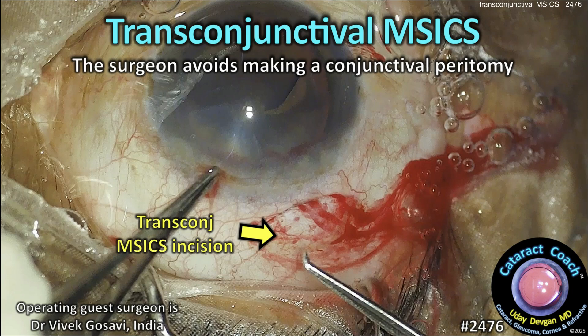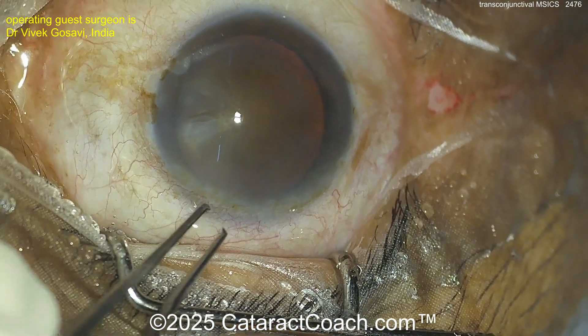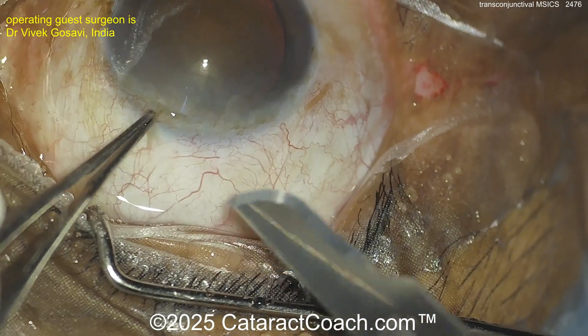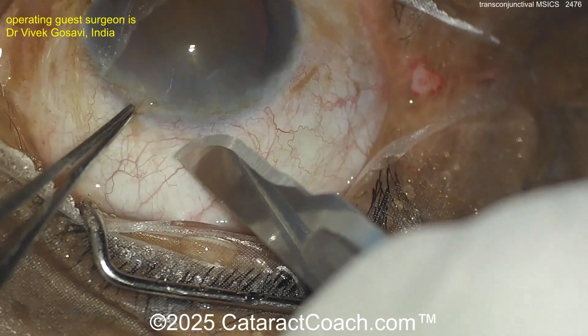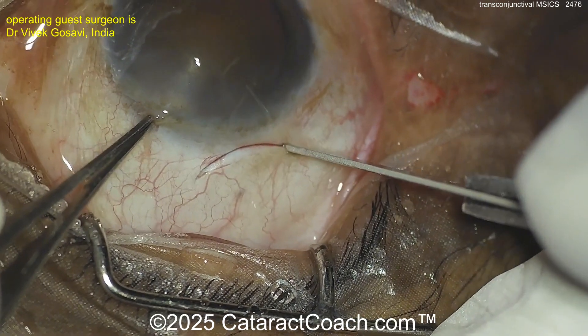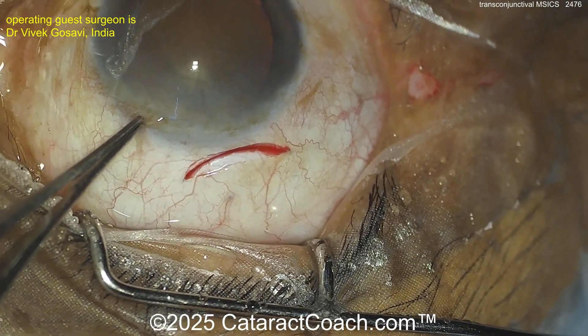Cataractcoach.com — transconjunctival MSICS. The surgeon avoids making a conjunctival peritomy by just going right through the conjunctiva. Here's the patient for MSICS surgery sitting superiorly, and now look — with the blade just going to make the incision through conjunctiva and through sclera. Look at that — a frown incision being made here.